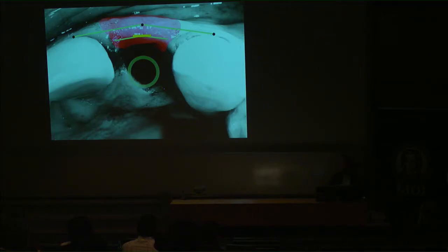This palatal position also facilitates fabrication of a screw-retained crown. Now, the smaller the diameter of the implant and the more palatally it is placed, the deeper it should be inserted to maintain the emergence profile of the prosthesis. That means subcrestal placement. The concept of subcrestal placement only pertains to a limited number of implant systems, so please choose the proper system for this procedure.